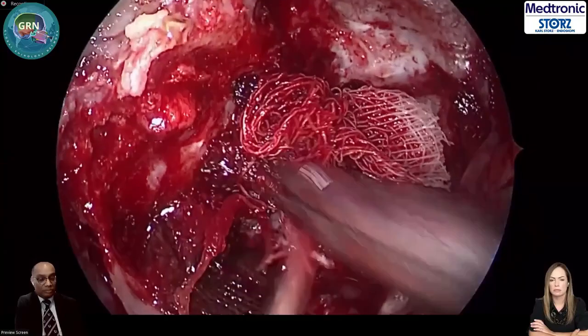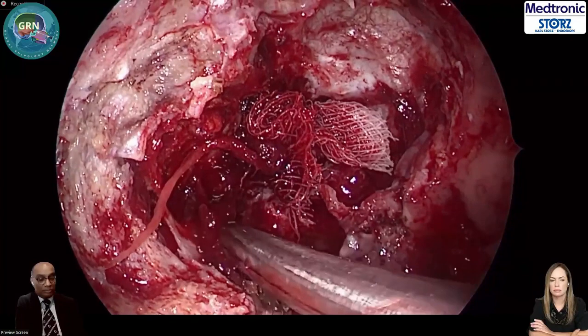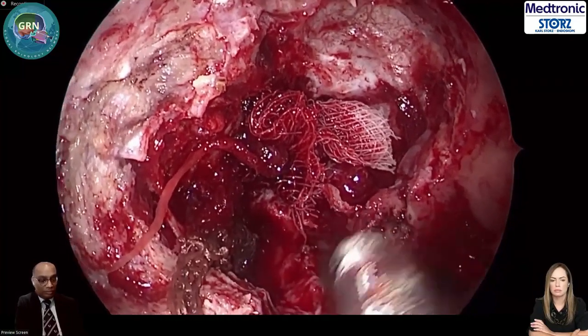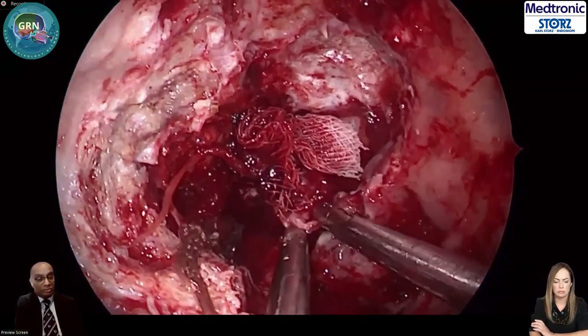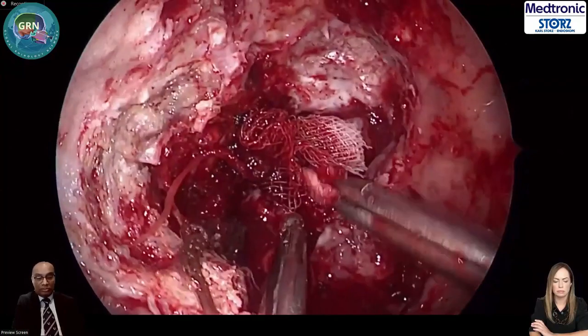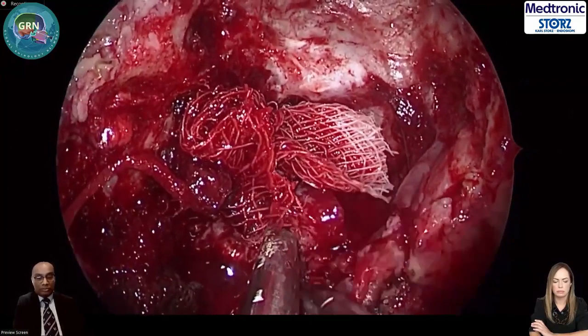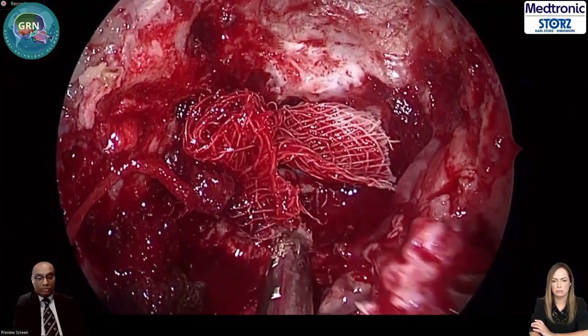On its own. But the small ones, you have to take care of all those small ones. I drilled the whole pterygoid wedge to the medial pterygoid plate. And you can see here that this is the... See here how the JNA is hiding behind the... See that? Can you see that?